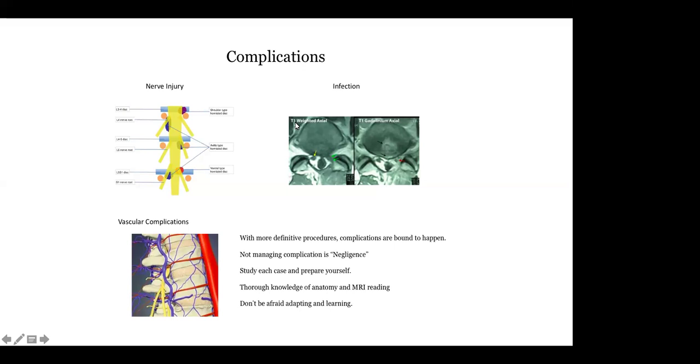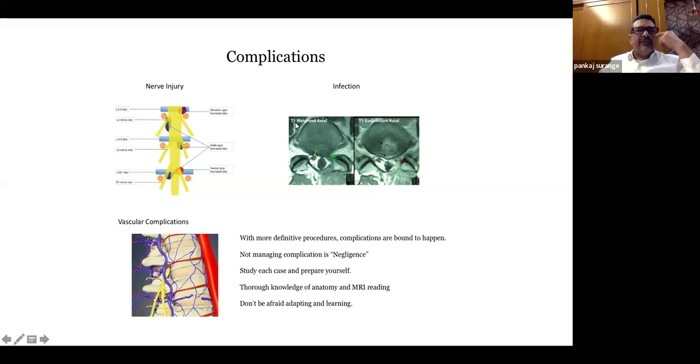In this type of dural tear, we only have to wait and watch. We should not do anything. These generally don't cause any harm to the patient. We observe the patient. Even if you find a nick intraoperatively, we can just wait and watch for some time.